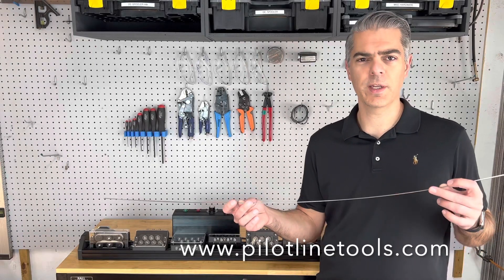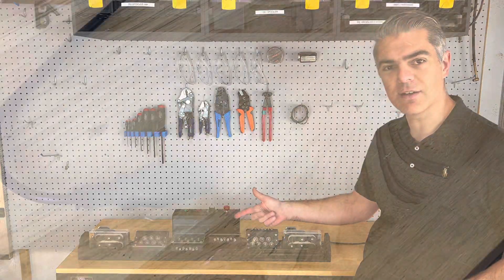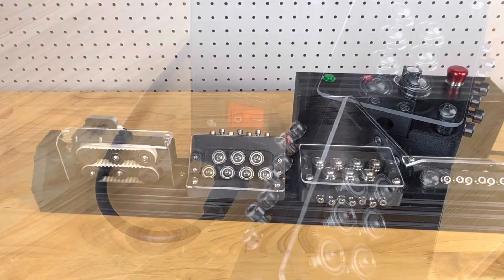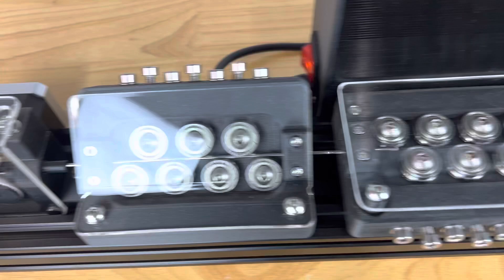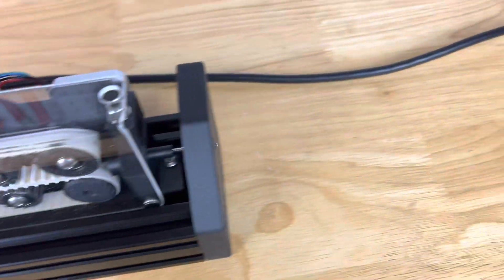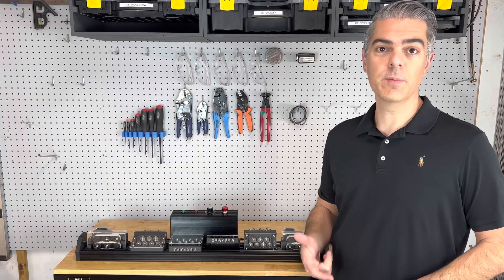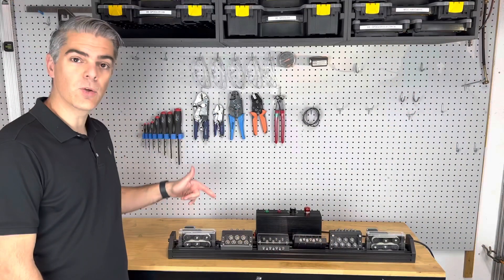Do you wish there was an easy way of straightening your catheter mandrels after reflowing? Well now there is! Check this out! PilotLine designs, manufactures and sells affordable in-stock equipment to meet your pilot production schedule and budget. This is our new mandrel straightener.